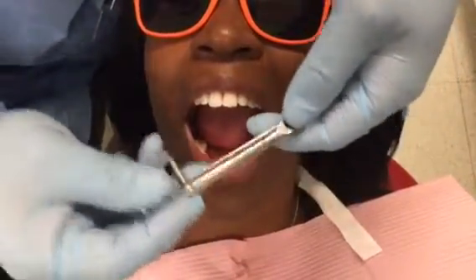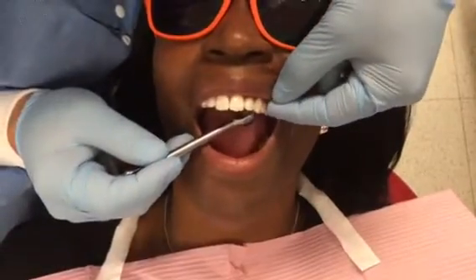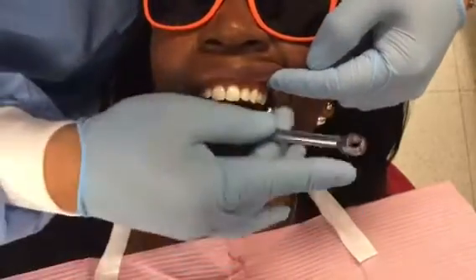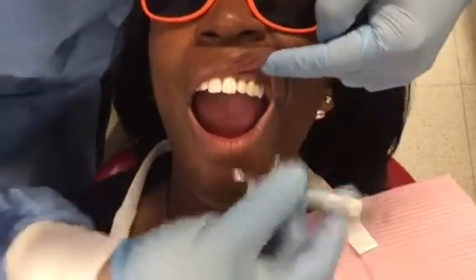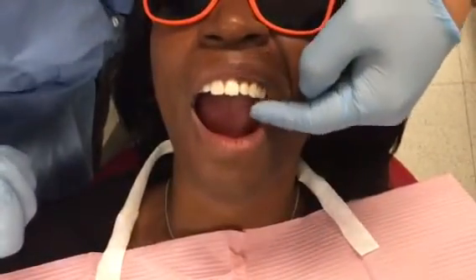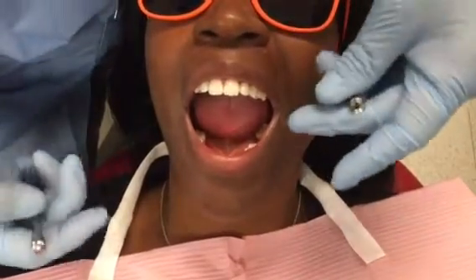We're going to explain how to torque a crown. The implant crown is already placed. We check the contacts, we check the occlusion, the gingiva, and everything. So at this point, we're ready to torque this crown.